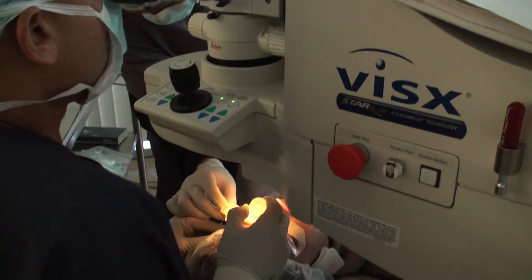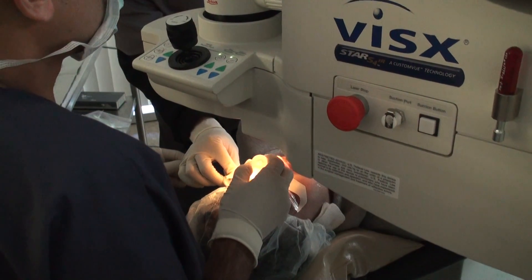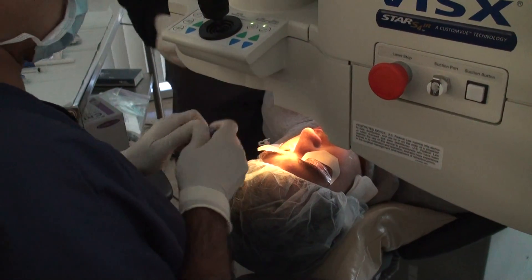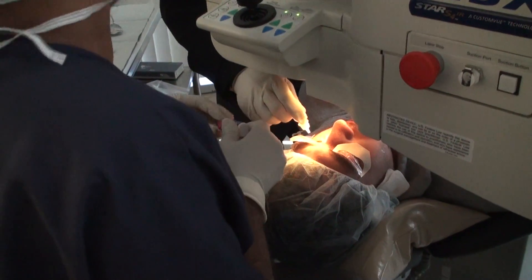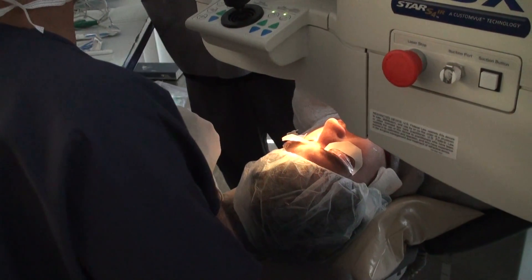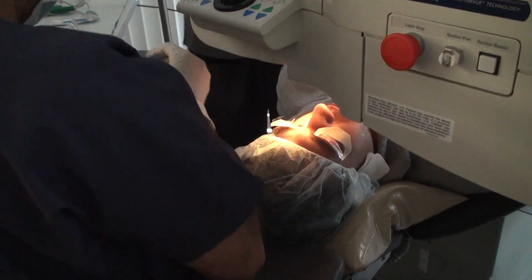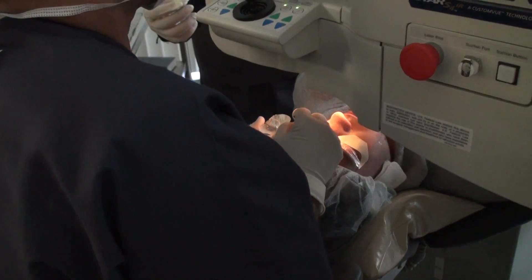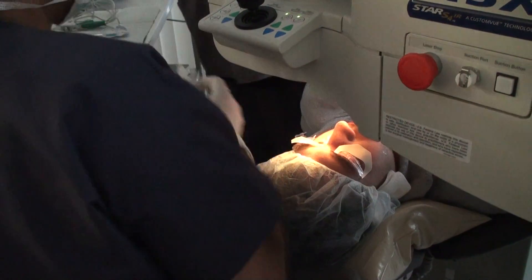So Derek, how was this eye? Good — a few seconds longer. I'm going to take a look at the cut. This is not from your stomp, but it helps to move your system.